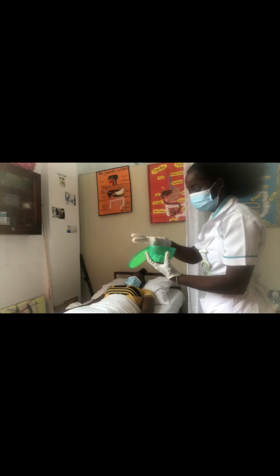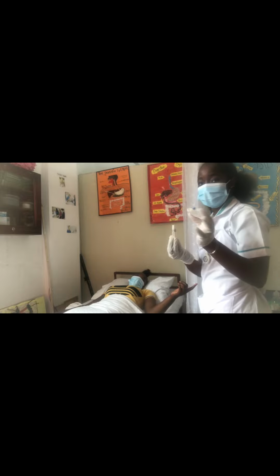I proceed with getting my wet cottons. Also applying more sanitizer to the cotton. And I'm cleaning the index finger because we're going to perform RBG testing. Clean the index finger properly while I gather my further equipment.